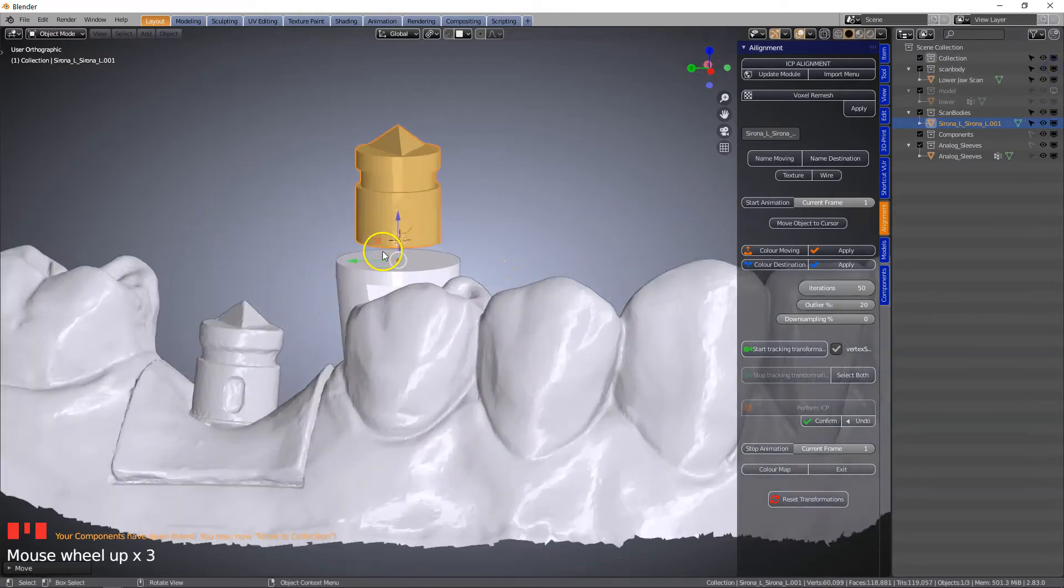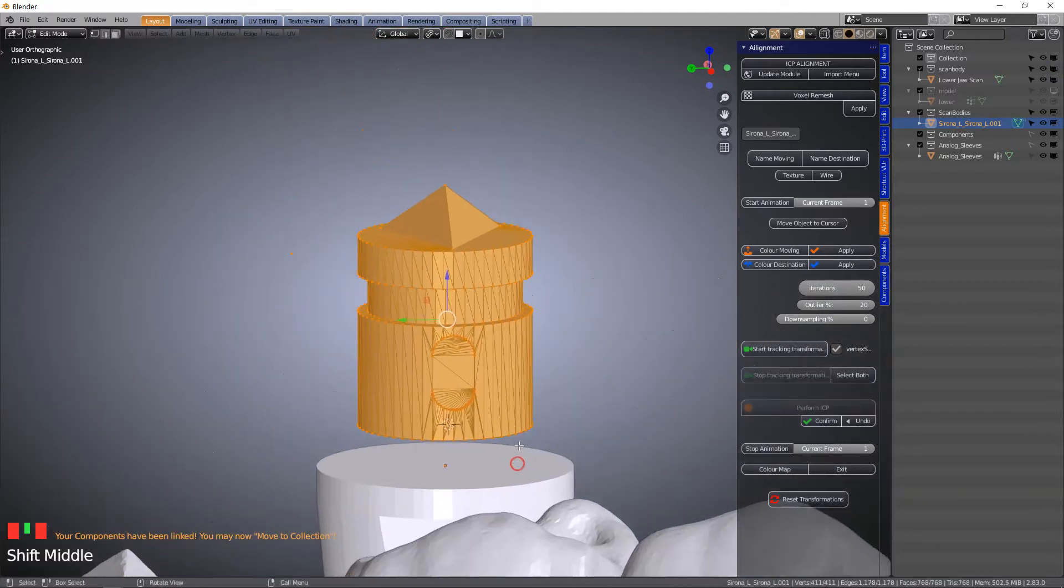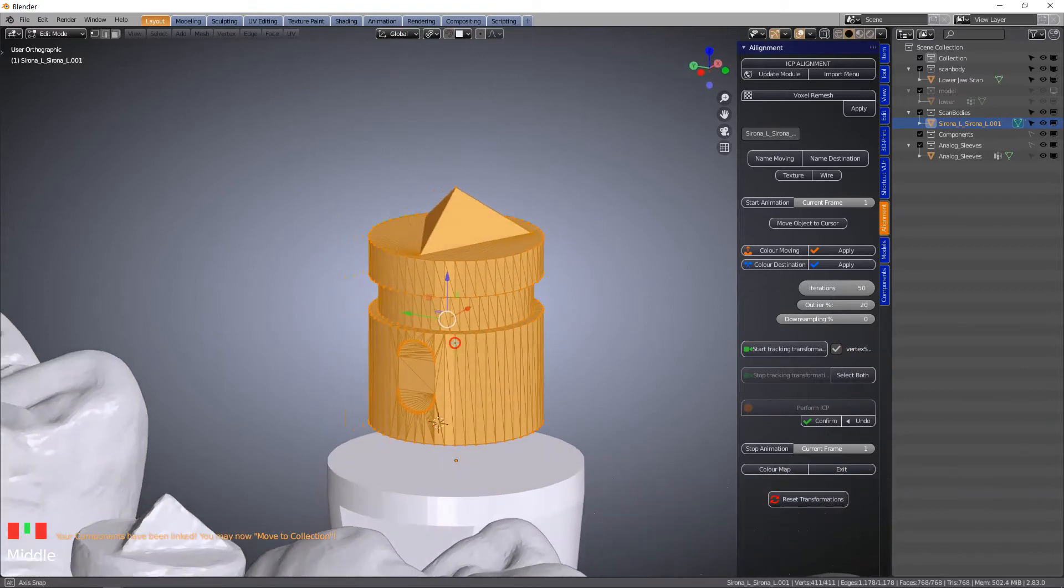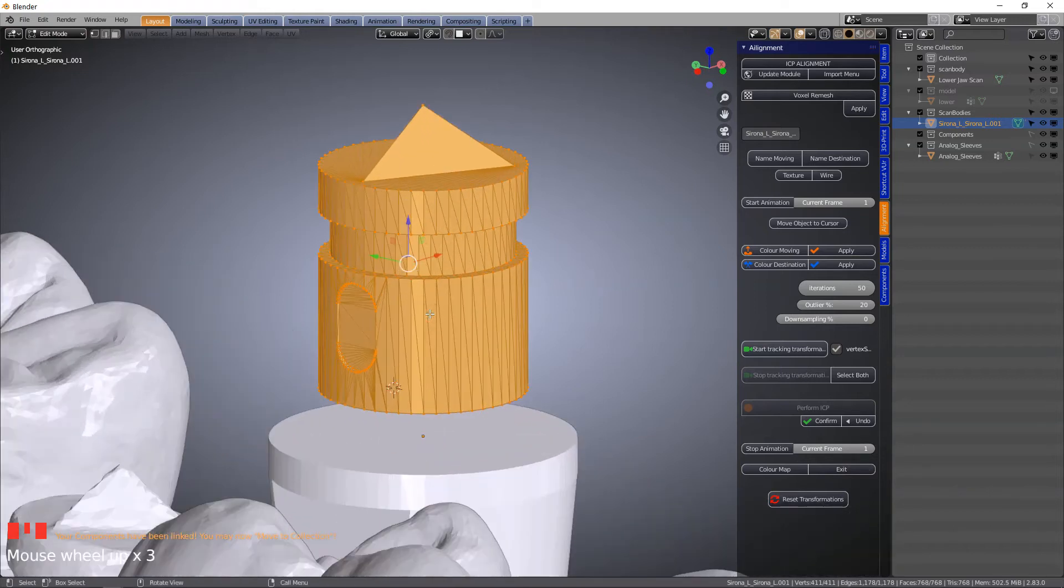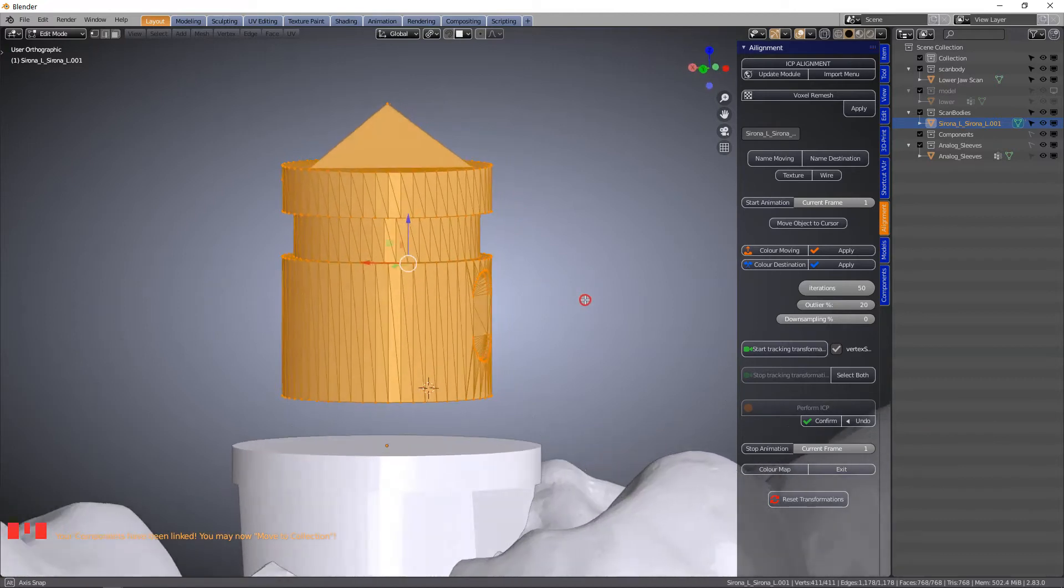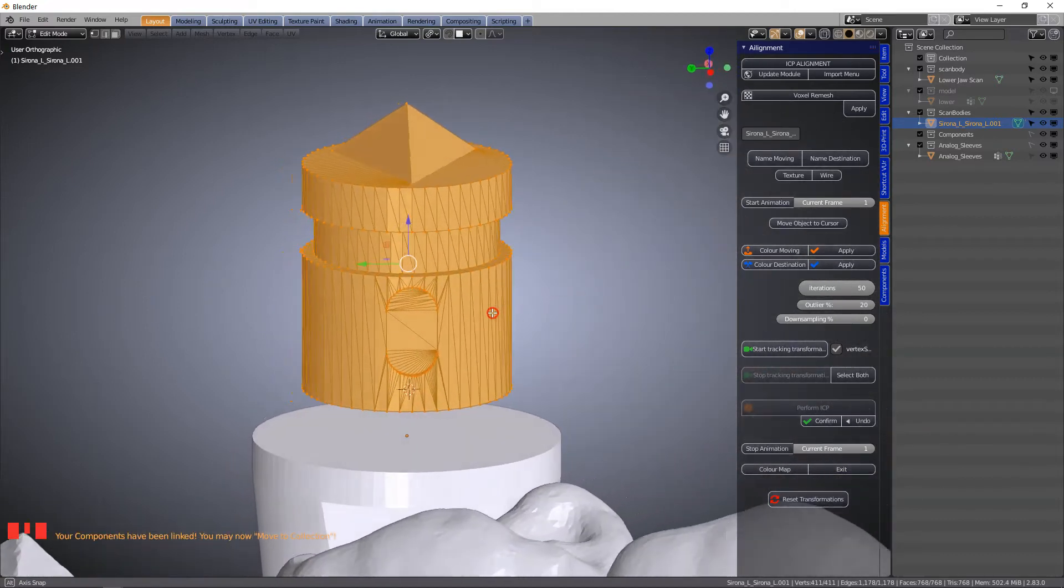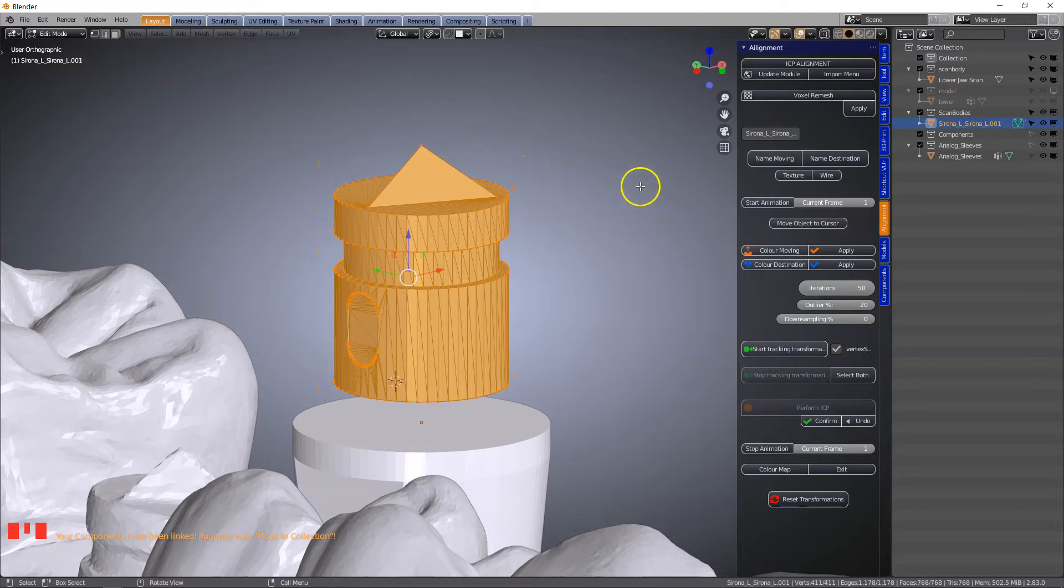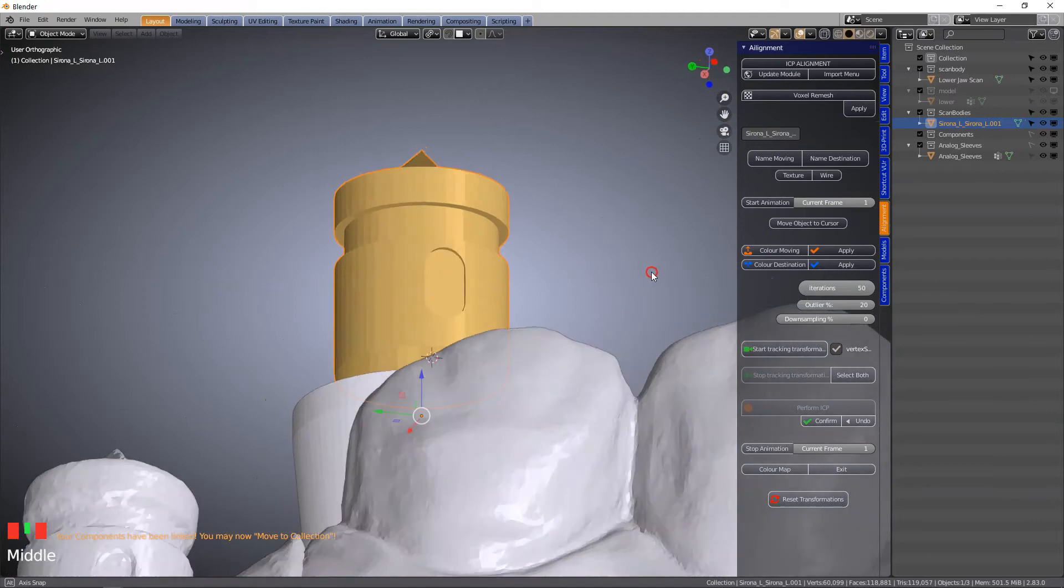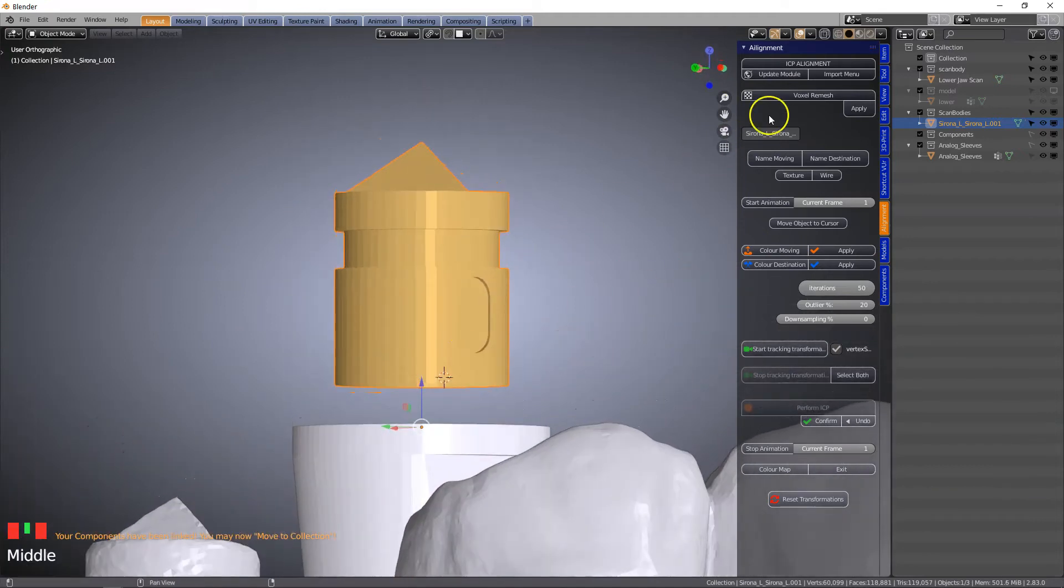The first thing I want to do is see the mesh structure of our analog. Now this is not a very suitable mesh structure. This depends on the manufacturer and how the geometry has been made for the alignment. We're going to go up to the voxel remesh and note it has a hole in it as well. This will close the hole.